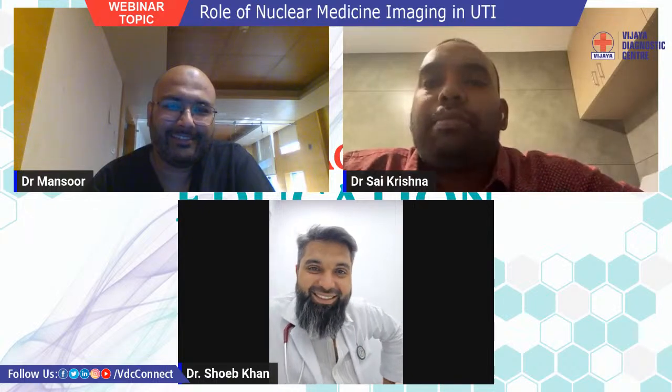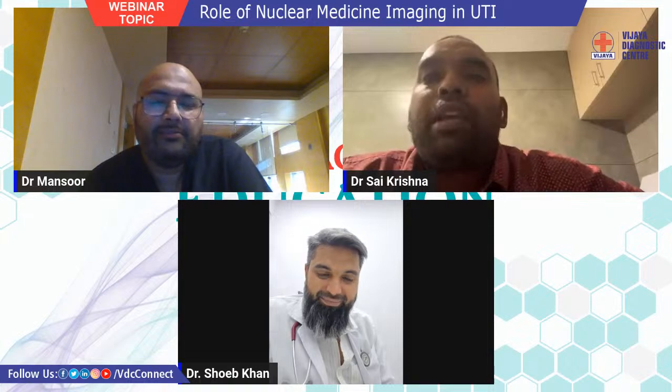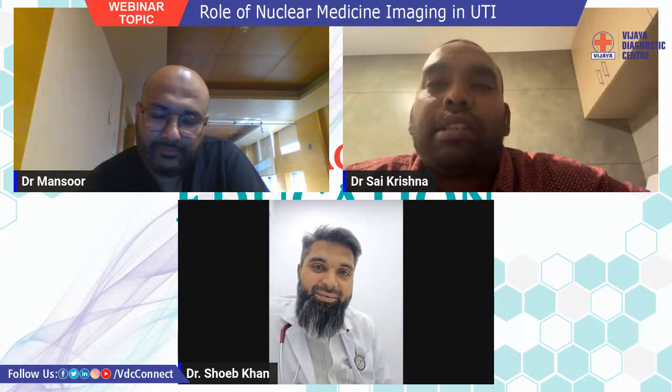Otherwise, just for the discussion's sake, sir, when you are giving the suprapubic injection directly in a full bladder, I'm asking the nephrologist, does it clinically help us to differentiate low pressure and high pressure reflux? And does it matter for the patient if you know about the low pressure and high pressure reflux?